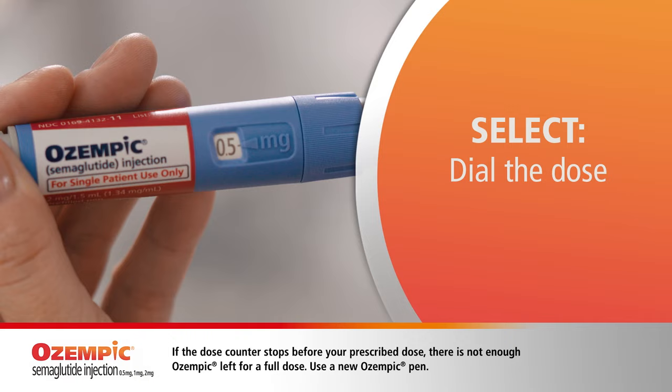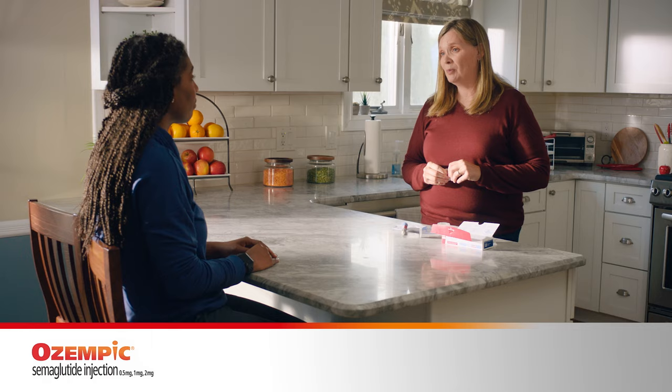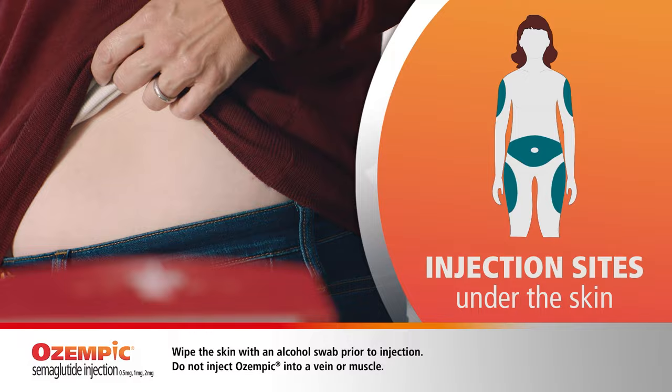Now it's time to select the dose. All you gotta do is turn the dose selector until the dose your doctor prescribed appears in the dose counter. Last time I injected into the skin on my thigh, but you need to rotate where you inject each time. Sam was saying you could inject into the skin on your stomach. That's right, and your upper arm too. So once you pick your spot, it's time to inject. Today, I'll be injecting into the skin on my stomach.